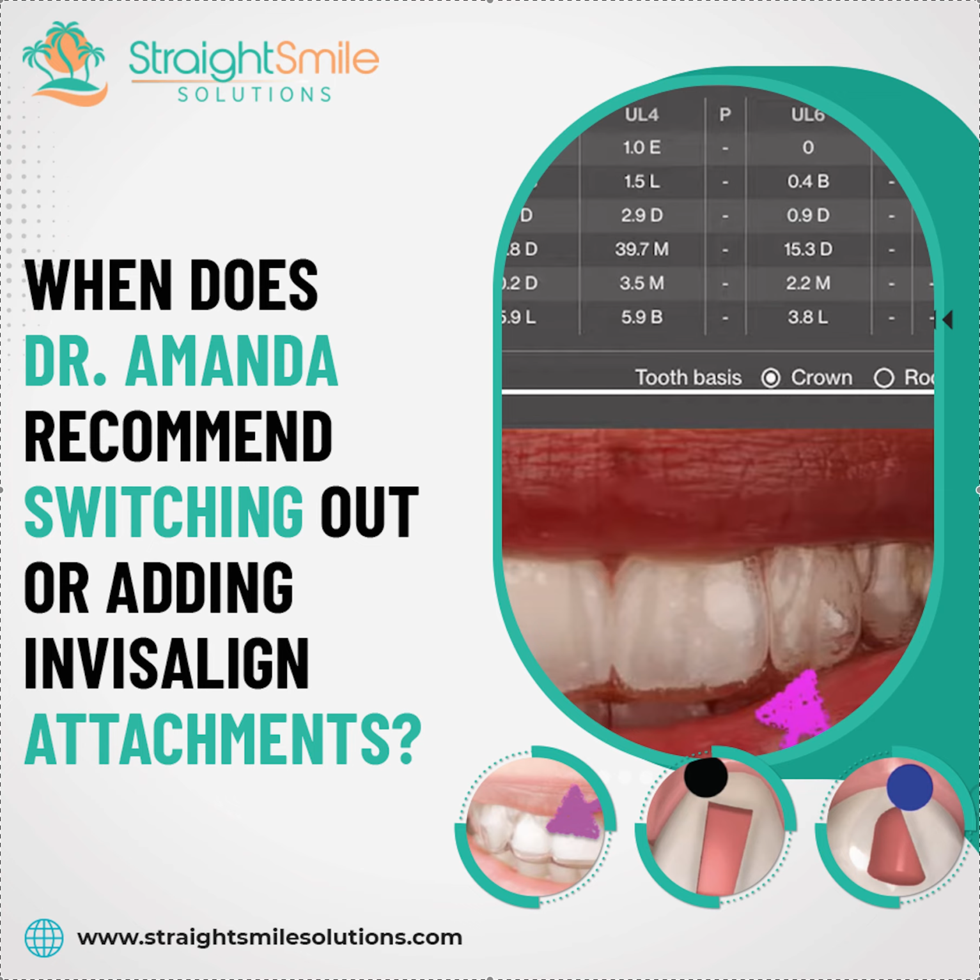And today I wanted to dig in a little bit more about Invisalign attachments. And this is going to be a video that's going to build on the other videos that I've made that are within my Invisalign channel, which are in my YouTube channel.